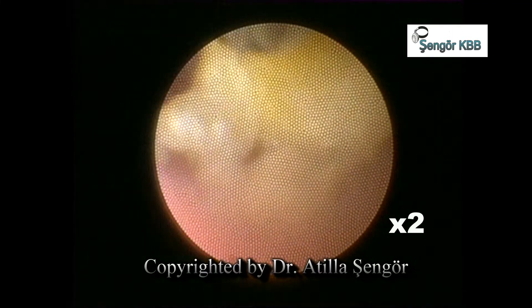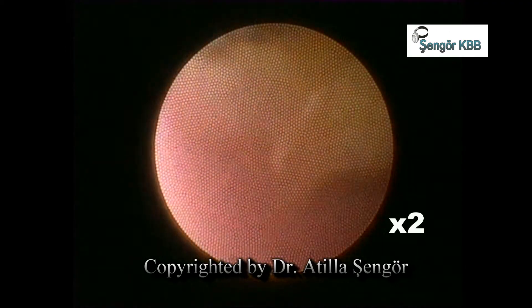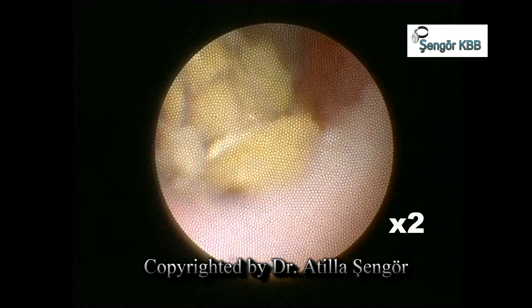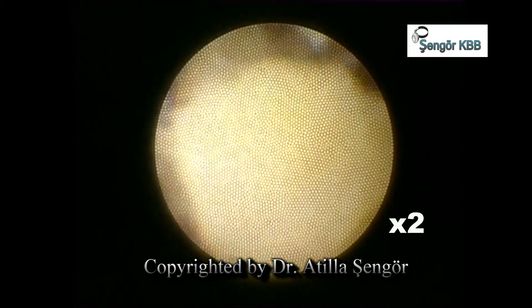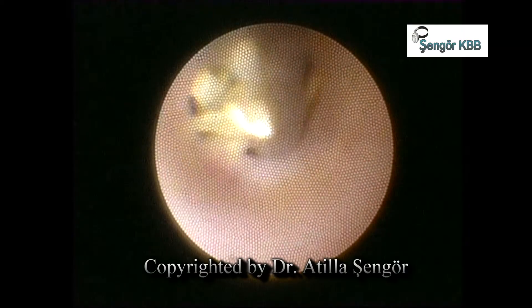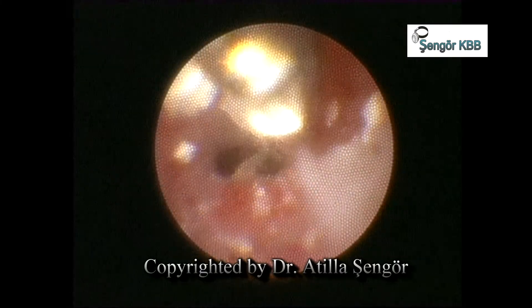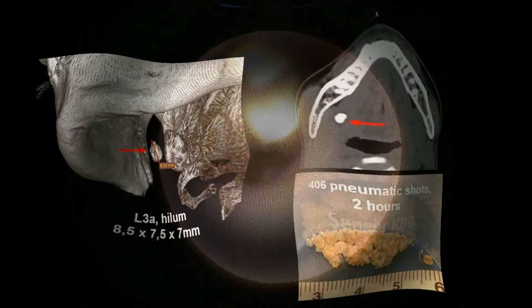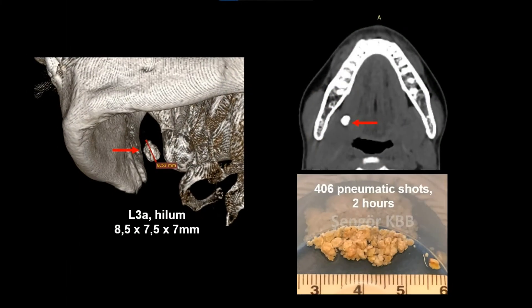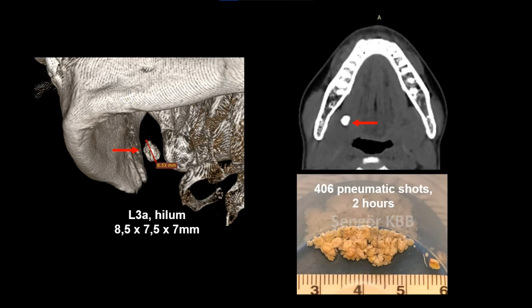This is the last big piece of the stone — I am fragmenting it. Fragments need to be small enough. I will also show you how I collect them. I removed the last pieces with this tool, which we call forceps. Let me show you the radiologic image of this stone again — pay attention to its location and size. I made over 400 pneumatic shots to this stone and removed all the pieces out of the submandibular gland in two hours.